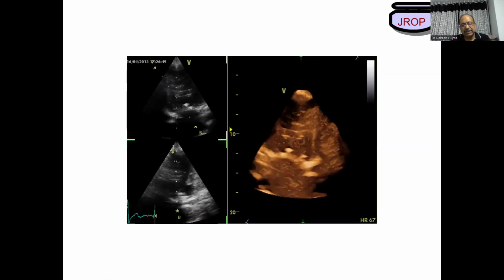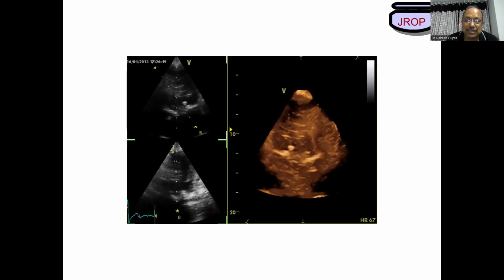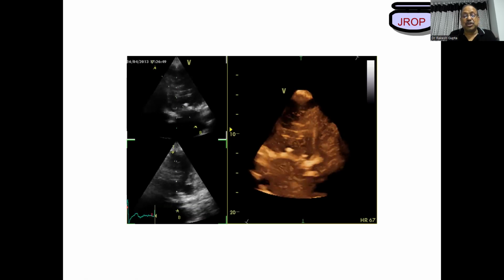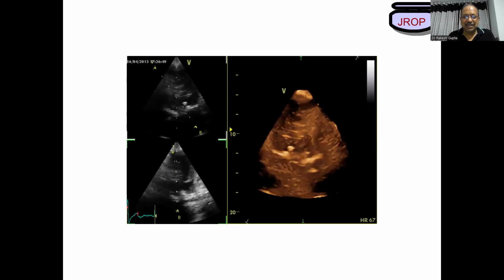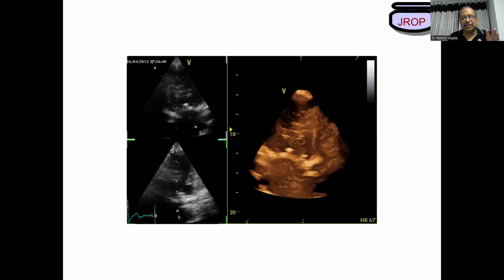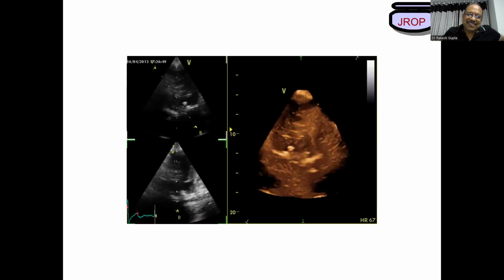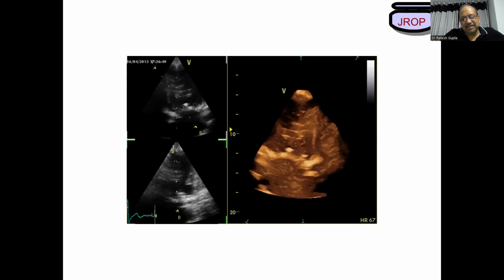Actually, true. And another important point is when these studs are also not there, in stentless valves. If you do not have a history of a valve replacement by a biological valve which is studless, believe my word, that's the most difficult thing you can ever do. Even as a beginner, it is looking like a native valve. Even thrombus also.